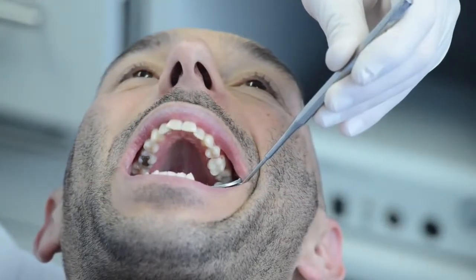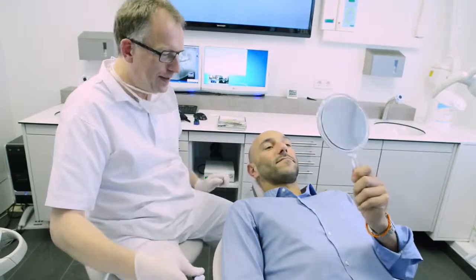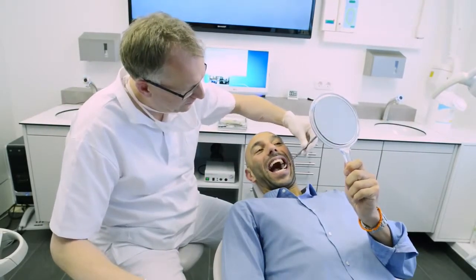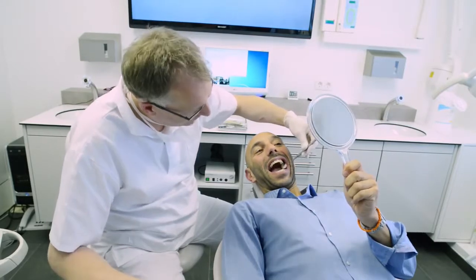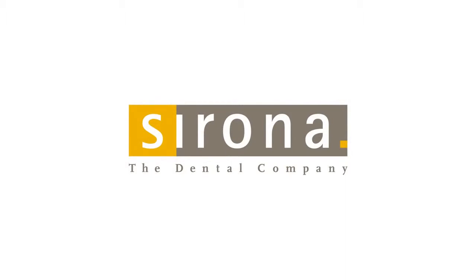Both cameras are easy to use and provide highly precise clinical results. You have the choice between two absolutely first-class camera systems. To be continued.